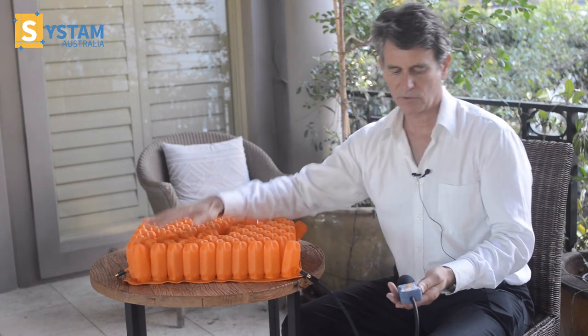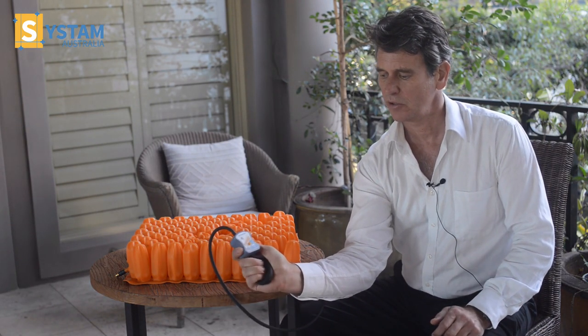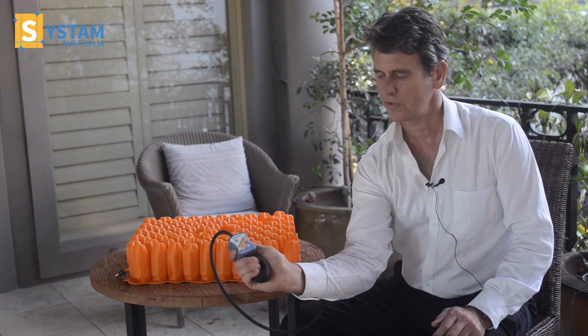I'm going to use my right hand, so I'm just going to switch hands. Hold it in one hand and I start pumping by squeezing the rubber bulb just with my three fingers on my hand.